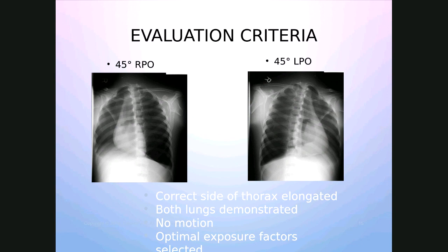Sometimes too, as people age, especially men, their nipples will calcify, and on a chest x-ray they can read the calcified nipples as a potential for cancer or some kind of mass, and they'll request follow-up views. Sometimes they'll suggest obliques with nipple markers, and you would literally stick those little stickies on the patient's nipples and then make the exposure.